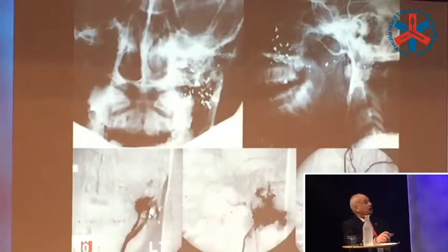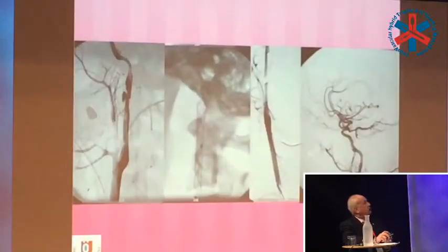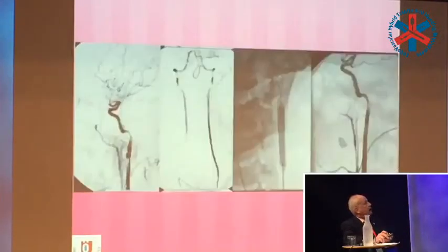This is where we can start. This is a young boy, a teenager, with bullets here, bleeding from the superficial temporal artery, treated with embolization. This is a 15-year-old boy with a bullet in the neck and rupture of the carotid artery. We put in a stent. We had to do an angiogram to make sure that the other side is patent, and a vertebral arteriogram, everything to make sure there is collateral flow, in case we have to embolize the carotid artery or the vertebral artery, which we do relatively often.